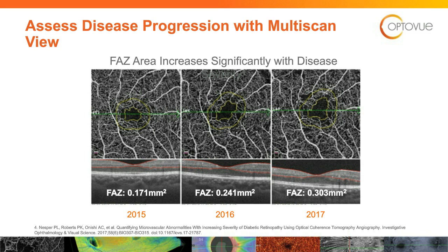How do you bill OCTA? At this point in time, there is no separate code for OCT angiography. It is the same as a regular OCT billing. So there is no additional code for OCT angiography.